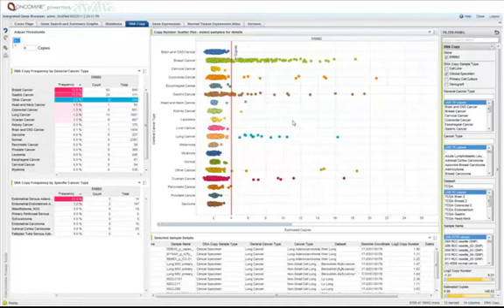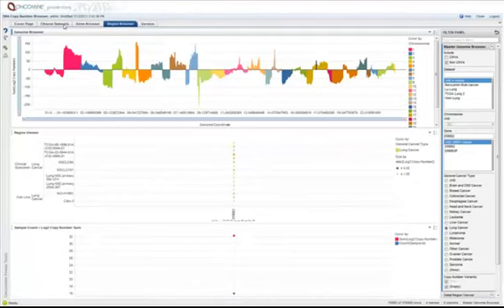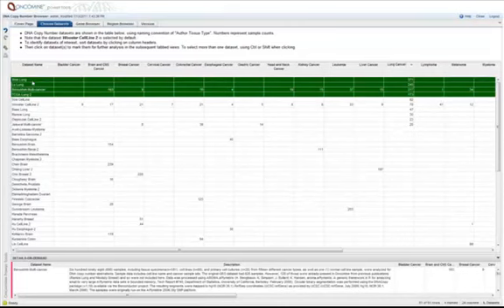Now the question is, though, are these amplifications in lung cancer likely drivers of these 1% of lung cancers? In breast cancer and gastric cancer, we know that these amplifications are relatively focal and center around the HER2 oncogene. What we can do now with our DNA copy number browser is ask this exact question. So what we're going to do is select lung cancer data sets for which we have copy number data. And I'm showing you here 4 data sets that have the greatest number of lung cancer specimens.